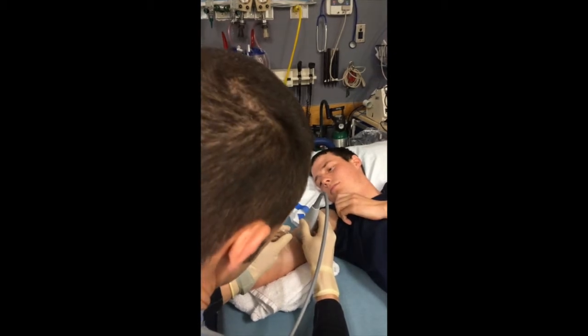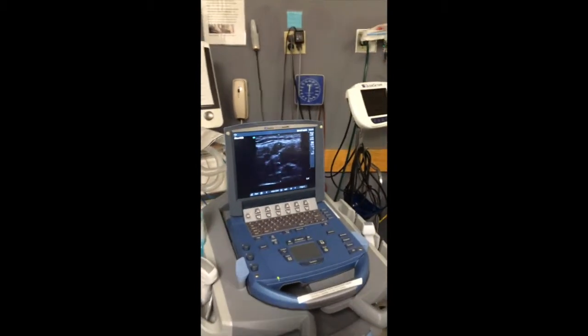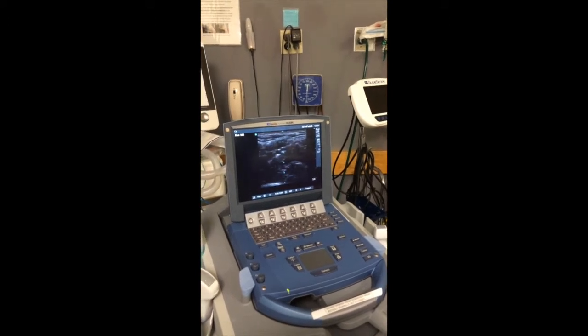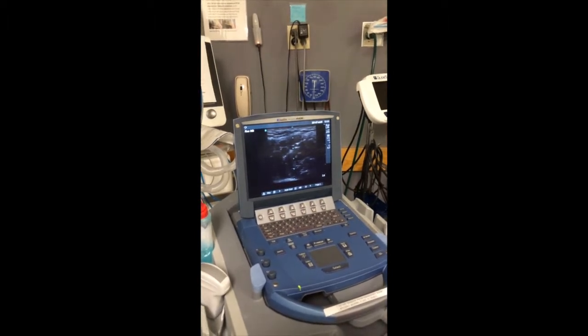And here we go — one, two, three. If you look up on the screen, there's something called the ring down effect. You can see me kind of bouncing right above the vein. That's how you know where your needle is — it's called the ring down effect.